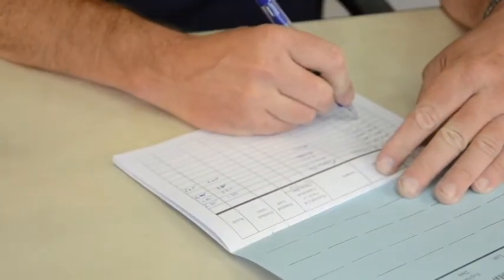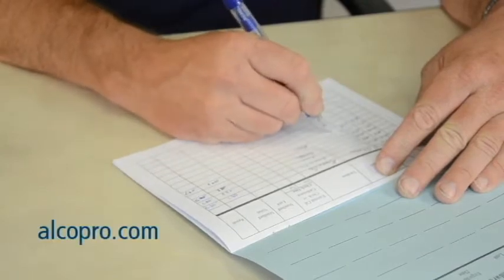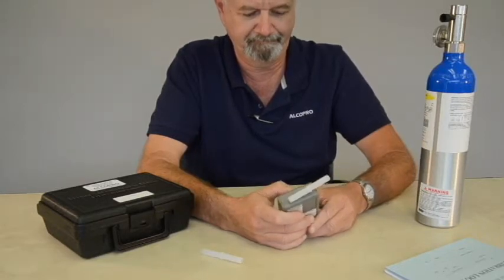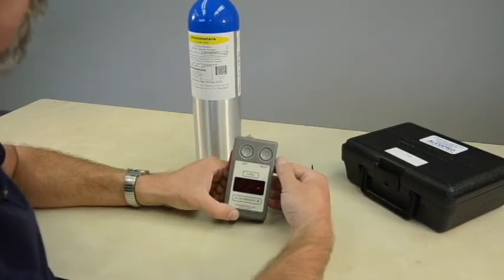You can purchase an accuracy check calibration logbook at alcopro.com. A calibration or calibration adjustment is a procedure for setting the device or instrument to a known standard. A best practice is to allow only certain staff who are proficient in the calibration procedure to perform a calibration adjustment.